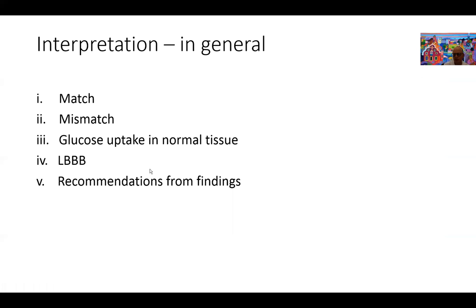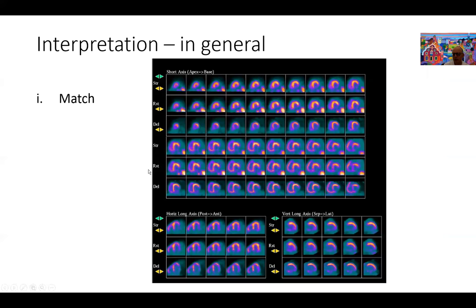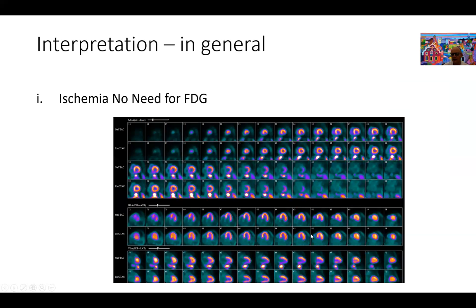The next step is to look at other patterns. This is a patient who comes with a match defect. Again, this is rest and stress. These are the FDG images. There's probably a tiny amount of viability right here at the basal lateral, basal inferior wall on the FDG images, but in general this is a fixed match defect.